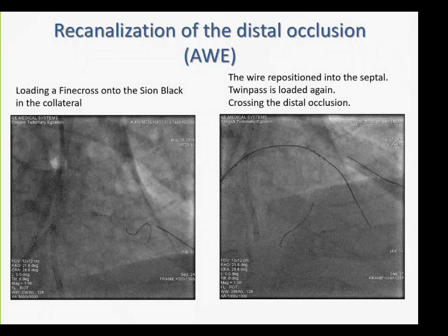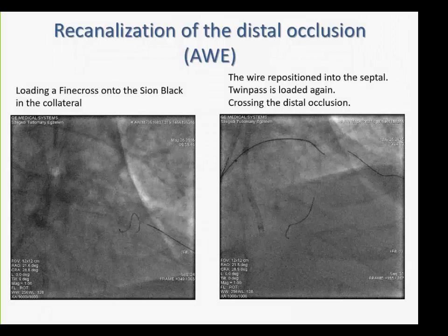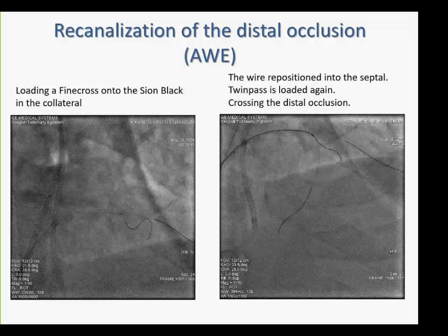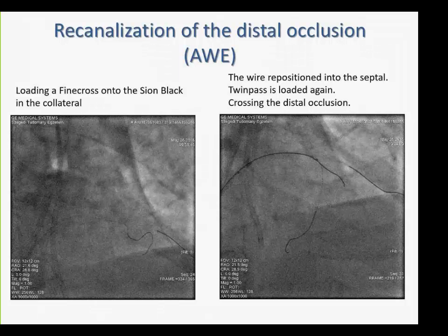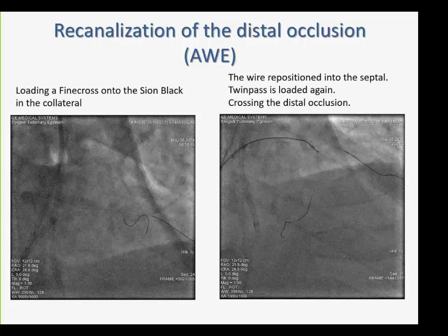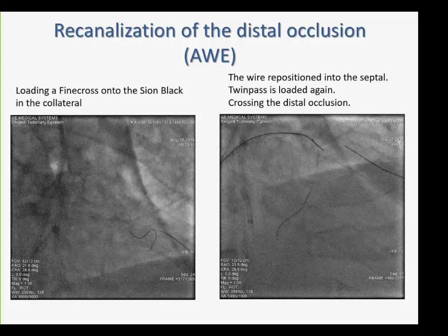So on the right angio, we can see the Pilot in the septal branch.